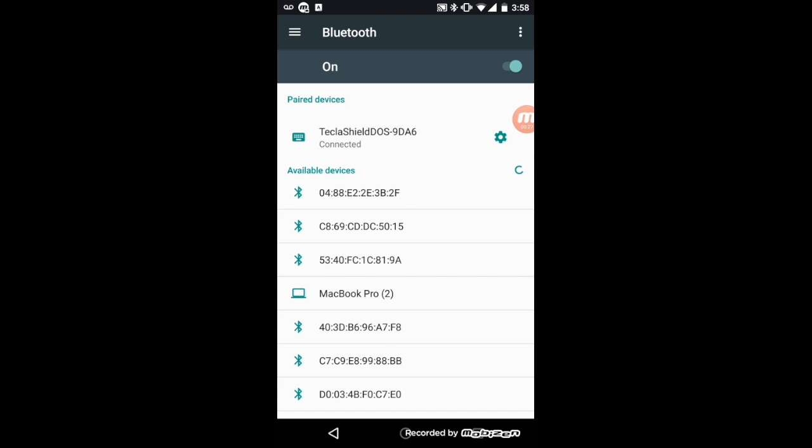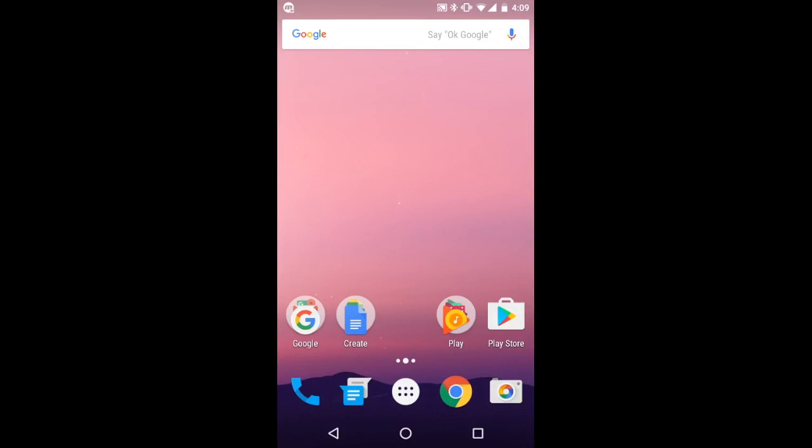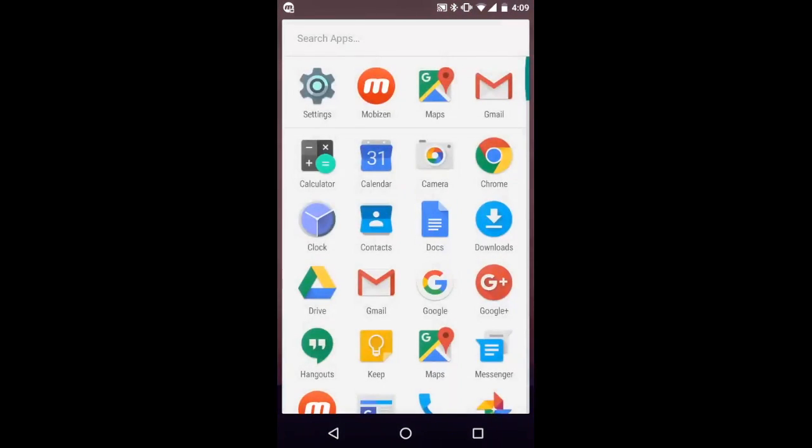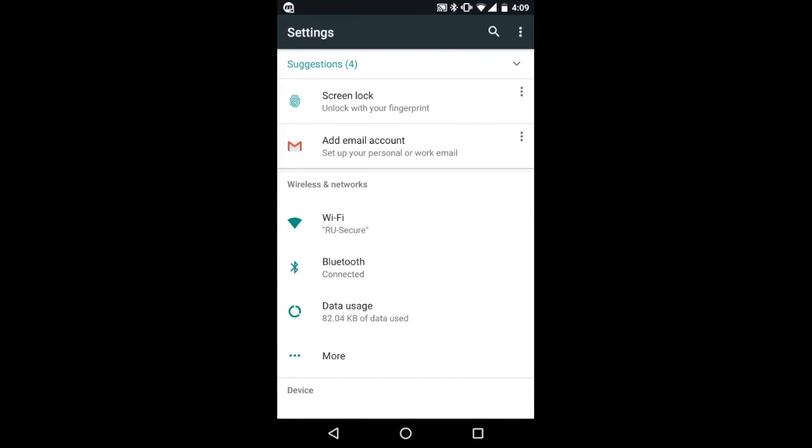Once Tecla Shield is paired, you can proceed to the next step. To assign actions to your switches, go to settings, then accessibility.